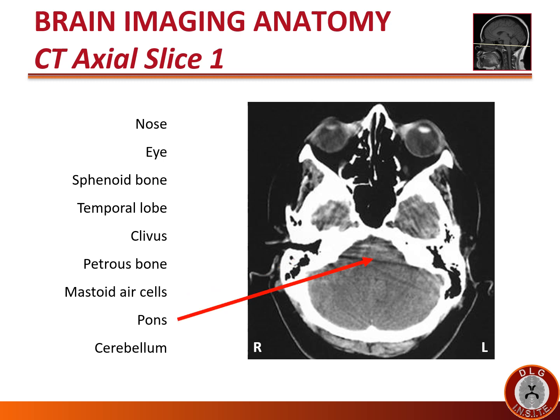The pons is seen in the center of this slice. Remember, the word pons means 'bridge' in Latin, and it bridges the two other components of the brainstem — the medulla below it and the midbrain above it. When you see the pons on an axial image, behind it lies the cerebellum. Please also note that the cerebellum crosses the midline; there is no fissure between the two sides of the cerebellum.